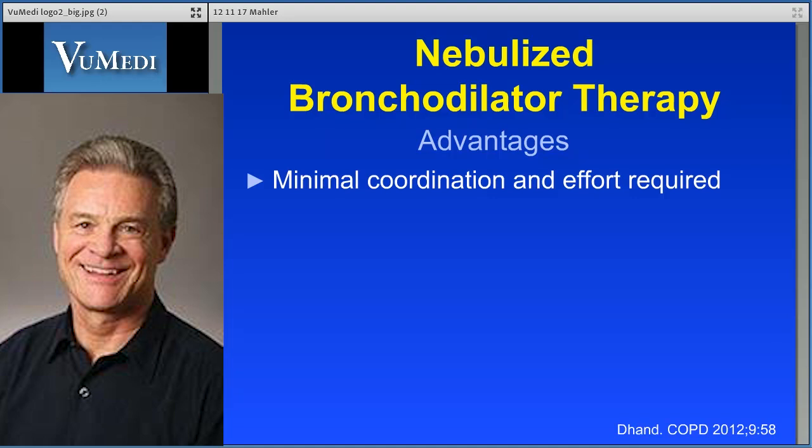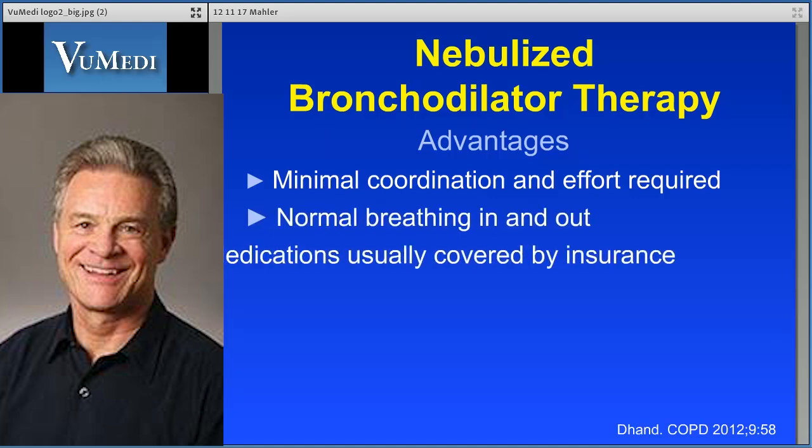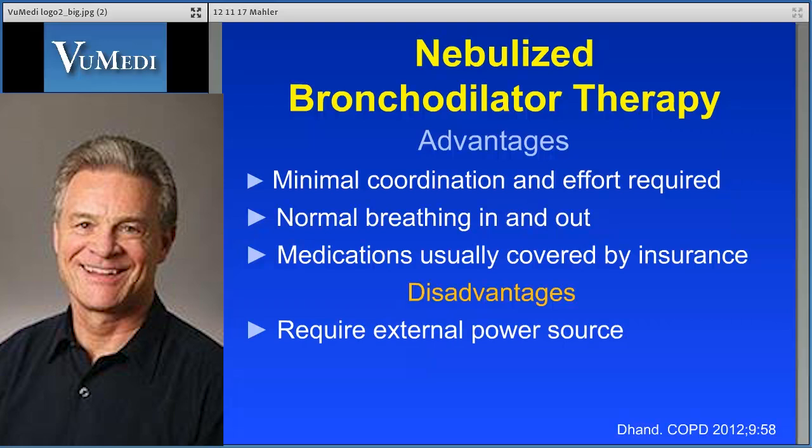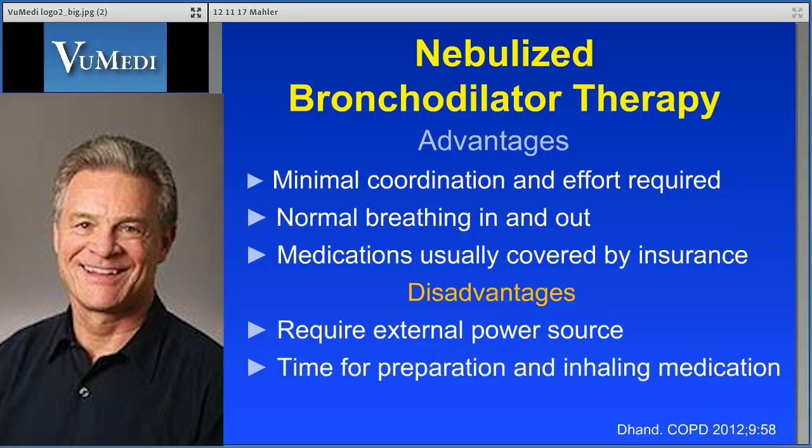There's normal breathing in and out, and medications are usually covered by insurance. The disadvantages of this approach are an external power source is required. There is time for preparation and inhaling the medication, and fewer medications are currently available for nebulized therapy than available by the three other delivery systems.